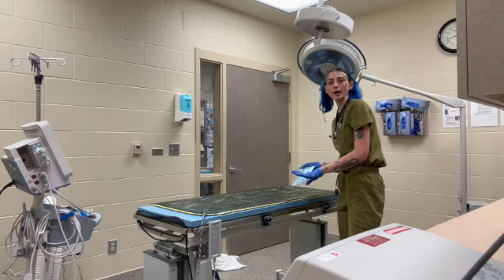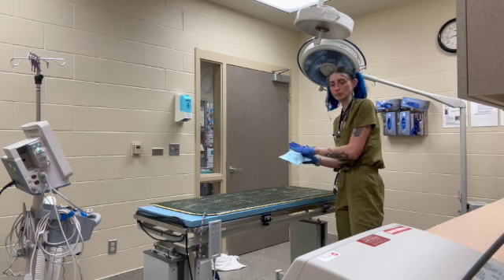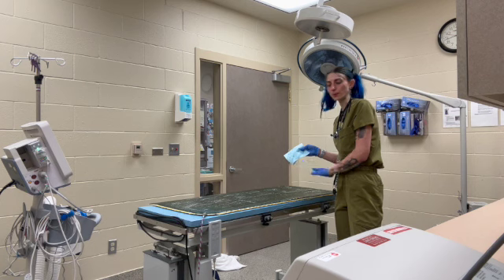And this is our cautery pad. We cannot use rescue wipes or rescue to clean this off, so I'm just going to use some isopropyl alcohol and then wipe it off with some water.